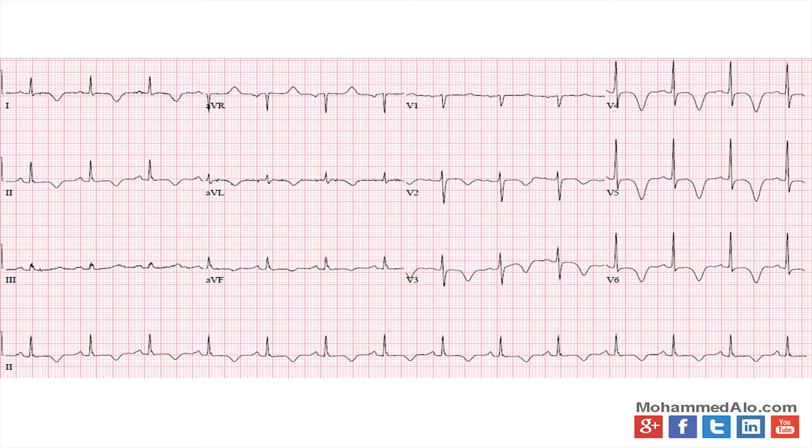Sometimes people call me and say, hey, there's an inverted T wave. Like if you look at AVF, that little T that's inverted there, that's not what we're talking about. We're talking about these big, deep T waves. These are the ones you worry about, not the one in AVF.